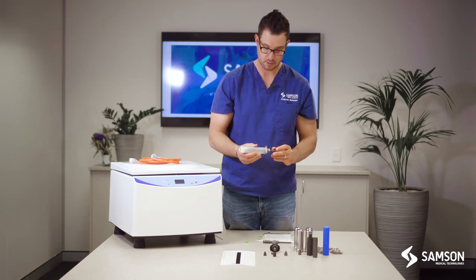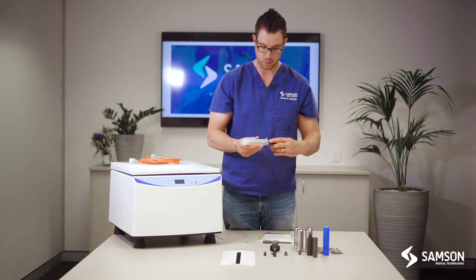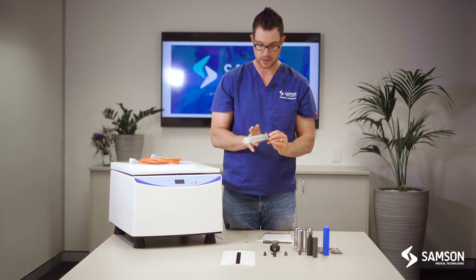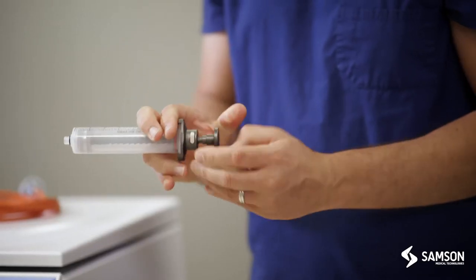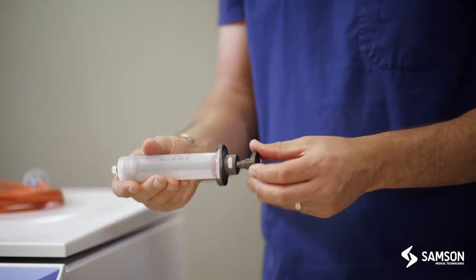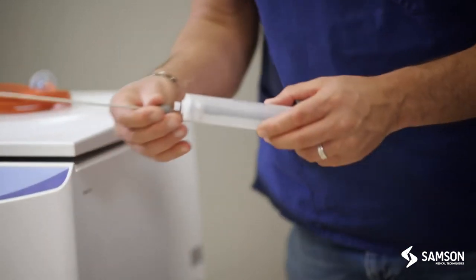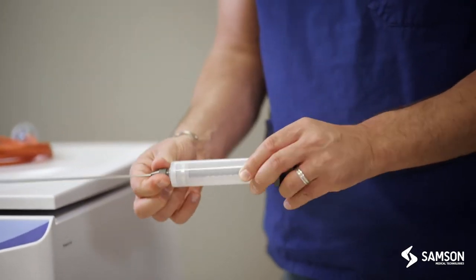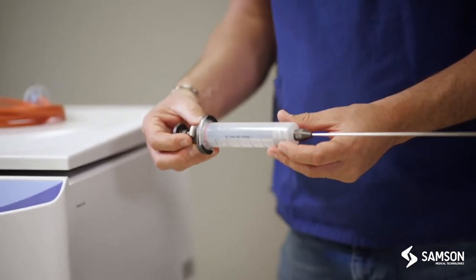There's a little grey button on the other side that, once pressed, we can then push the plunger down as well. We can then take our cannulas and connect that to the syringe, and then that is now ready for harvesting.